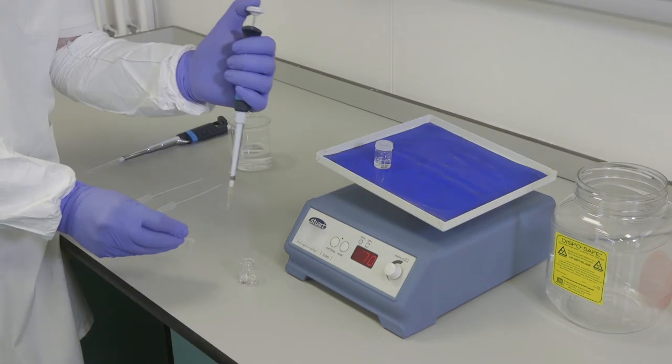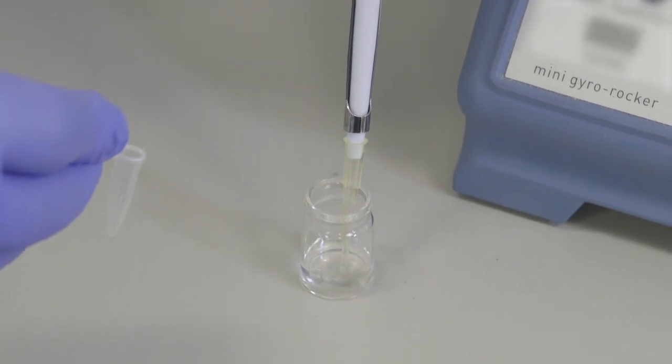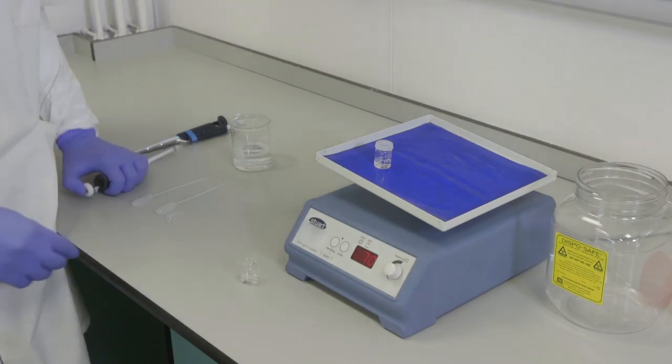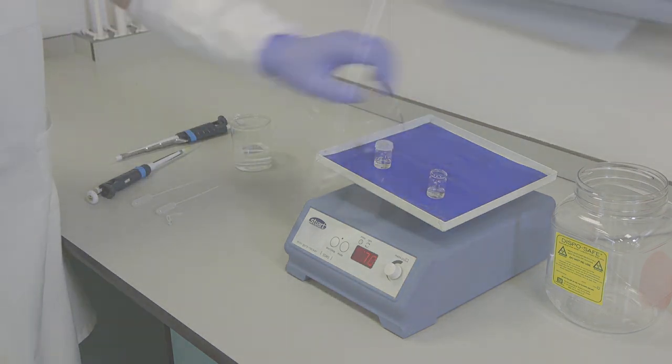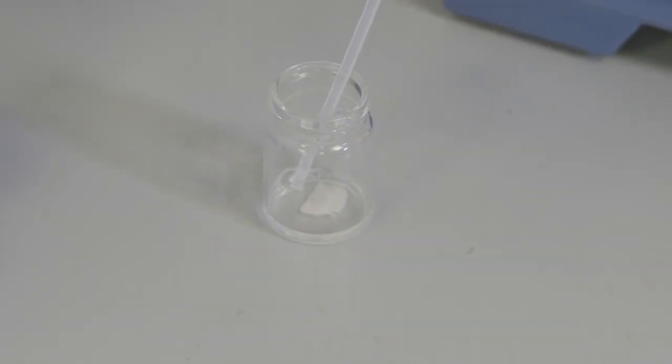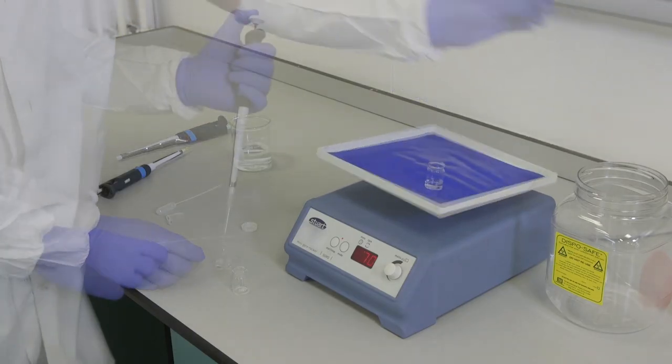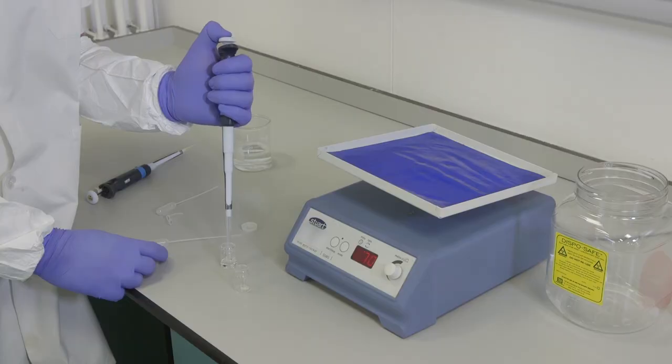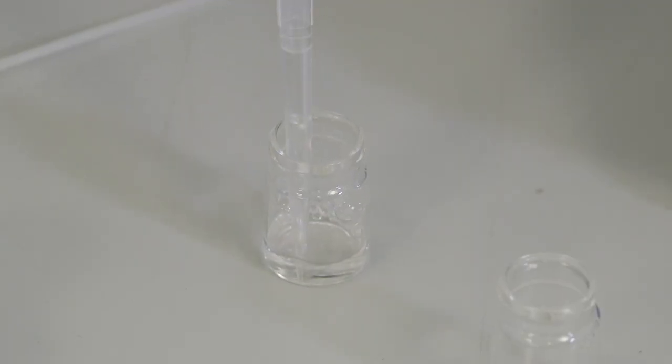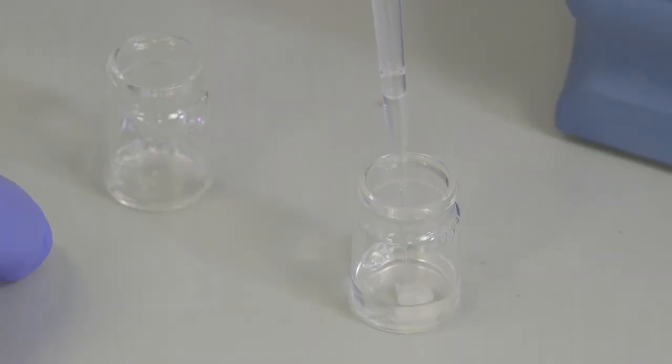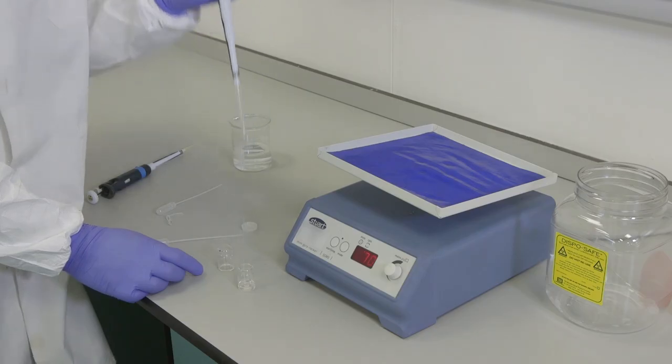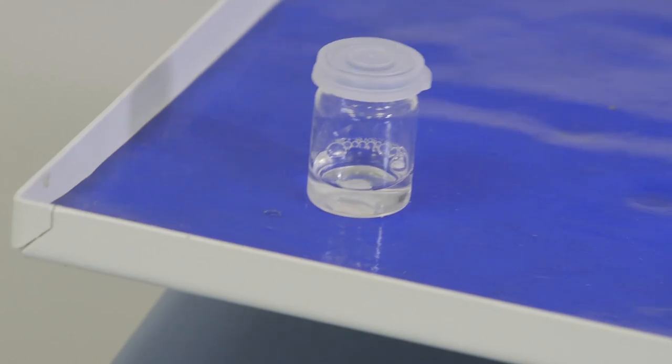Prepare the blocking solution by adding 4% Normal Goat Serum to 1% Tris Triton solution. Carefully remove the 1% Tris Triton solution from the last wash and add the blocking solution to the brain slice. Leave to block for 1 hour with agitation.